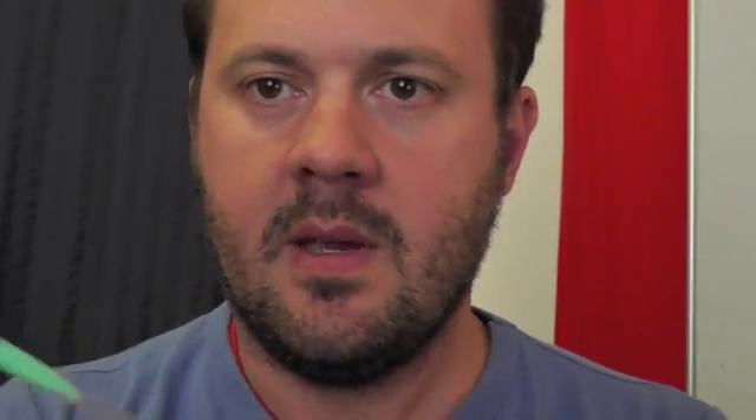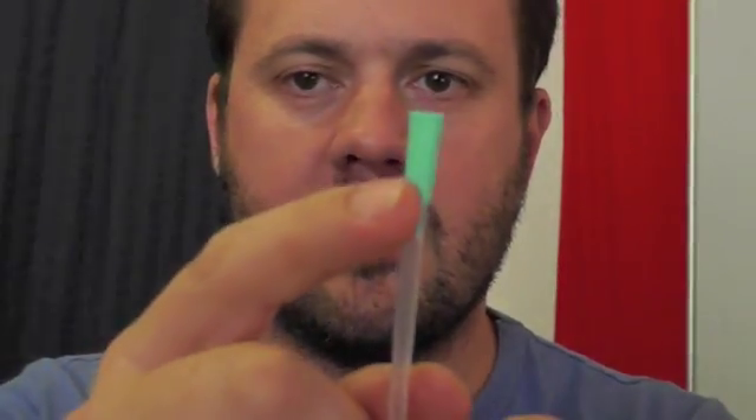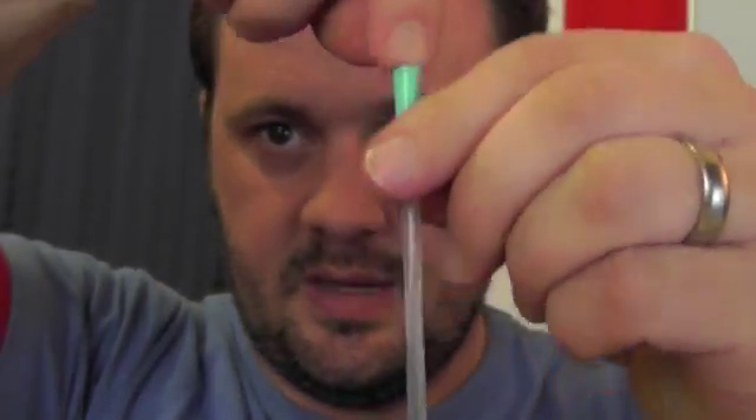That involves a thing called a mixing cannula. Most EDs have these lying around. They're a bit of clear plastic tubing with a little green nozzle on the end. That's actually removable, and in an upcoming video, I'm going to show you how to use this to do end-tidal CO2 monitoring. But most of the time, you'll find these lying around, and they're designed for putting syringes in the end and drawing up medication out of bottles, often for paediatric-type medications.